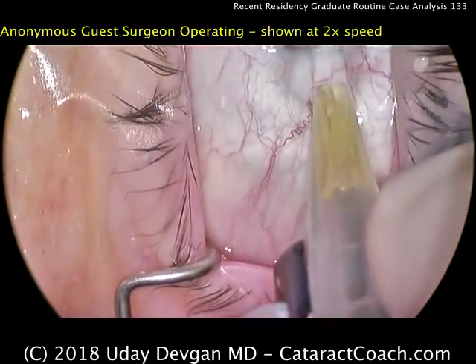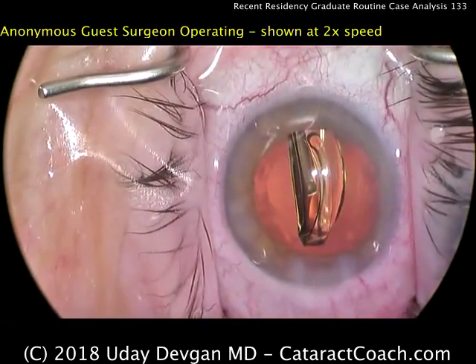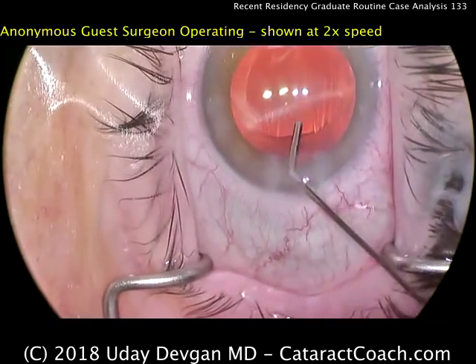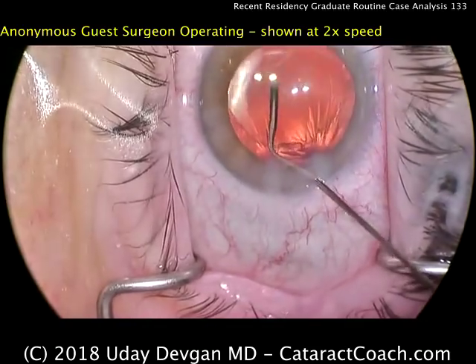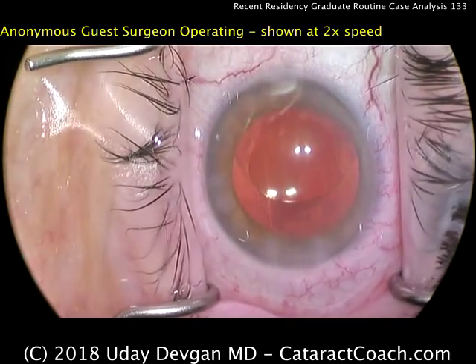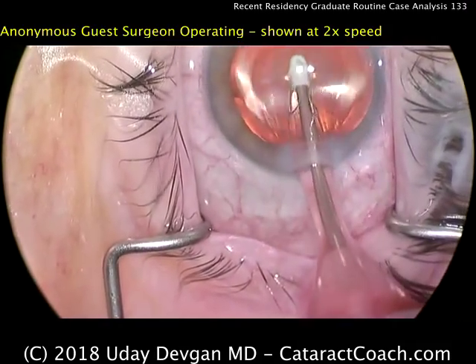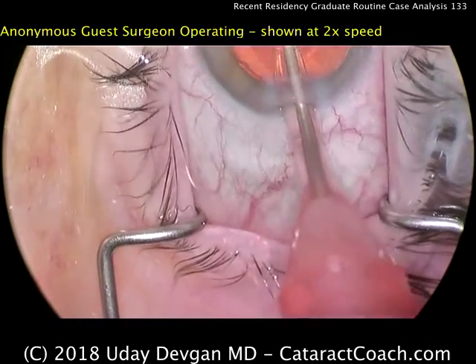The lens has been loaded up — looks like a single-piece acrylic lens. Here I'd encourage the doctor to fixate the eye so it doesn't get shoved toward the nasal side as much, but that looks great. Lens going in, good position, nicely rotated. We can see a nice overlap of the optic. Balanced salt solution was used to inject underneath the optic to evacuate the viscoelastic. Going underneath the lens is important for an advanced surgeon, so this young doctor is certainly on the right path.